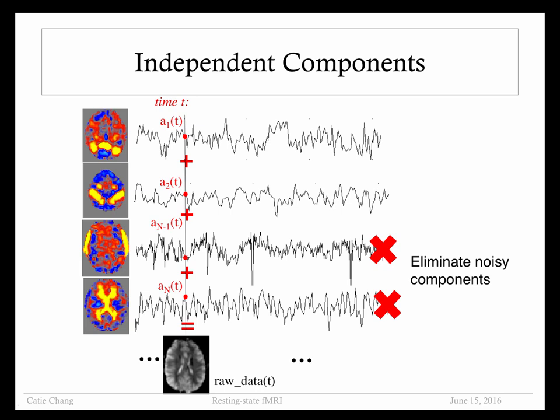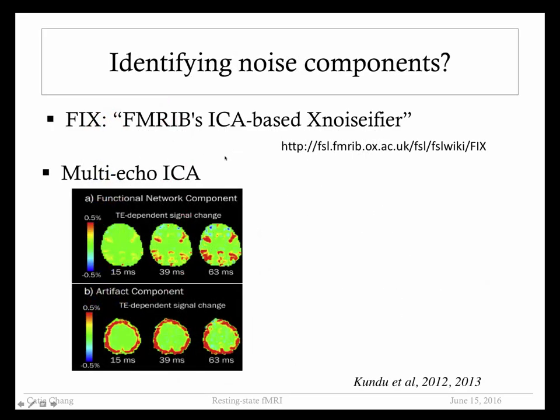But I also wanted to use this slide to show that ICA gives you a useful visualization of the structure of your data, and it can be helpful for just looking at what patterns are there and maybe helping you discover types of noise that you might not have expected or thought to even model.